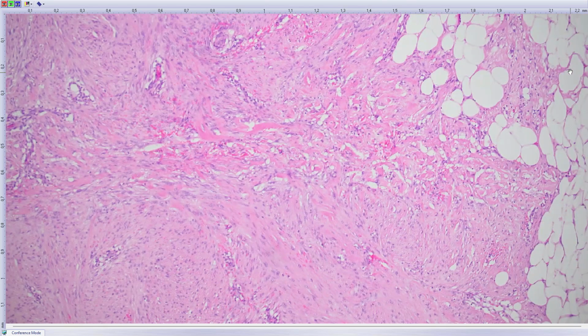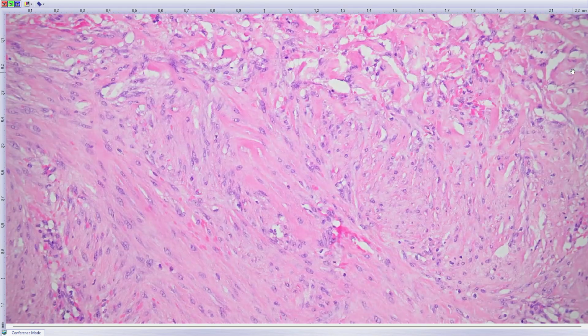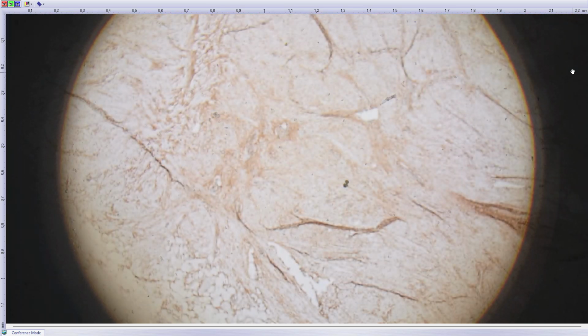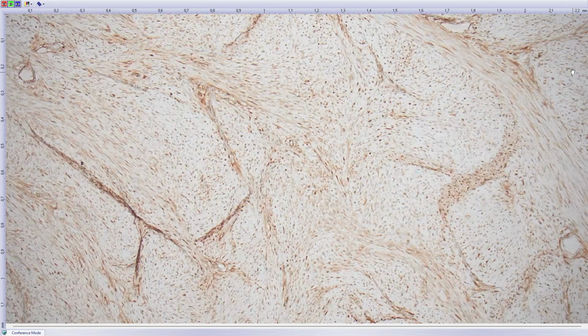This is very basic pathology, and this is quite a typical image. These long, sweeping fascicles of cytologically very blunt spindle cells, and the prime differential diagnosis is fibromatosis or desmoid tumor. And again, it's not really necessary, but it's nice to have beta-catenin staining, and as you can see, it gave nice nuclear and some cytoplasmic staining, which is abnormal.